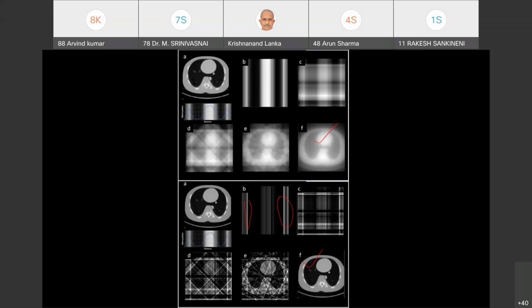So in that way we can get all the beautiful details. See, this is the original profile of the cross section. Whereas if you use simple back projection, you get only this, from using various projection angles.